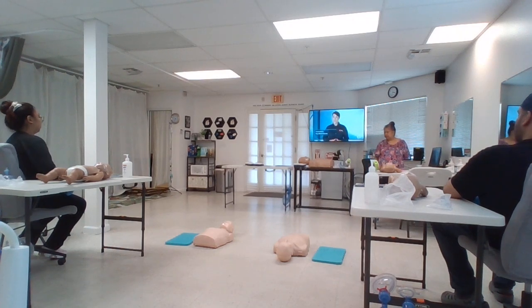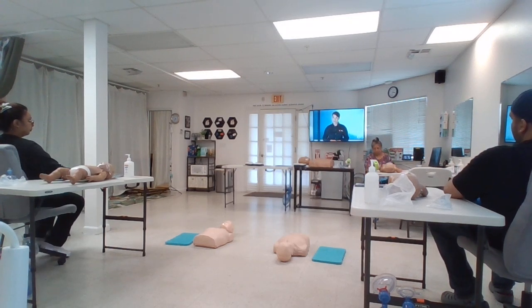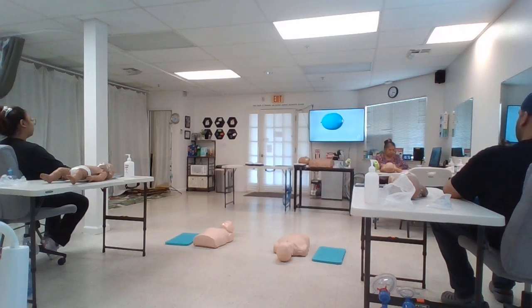Providing effective ventilation is critical to successful high-quality CPR, especially in respiratory-related emergencies such as drowning, anaphylaxis, and asthma. Guidelines recommend against excessive ventilation during CPR, and research suggests that some rescuers are less confident and less effective when using a bag mask device on their own without assistance. Because using a bag mask device is such an important skill and is common in the healthcare setting, we'll work on it now. Bag mask devices consist of a ventilation bag and a face mask, and they come in a variety of sizes. You can also use supplemental oxygen with the bag mask device.